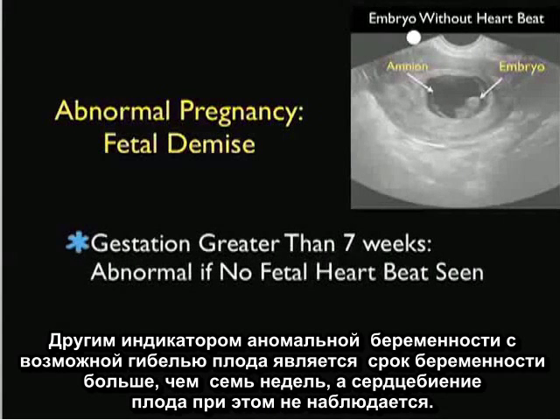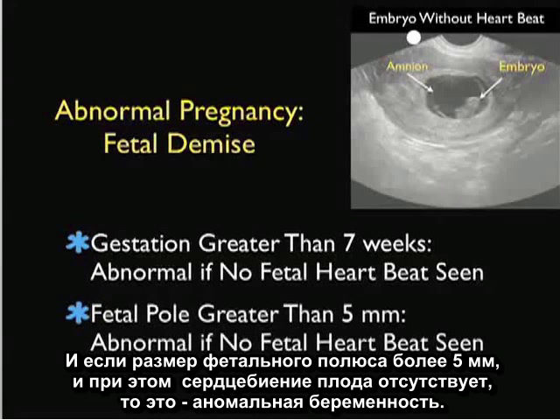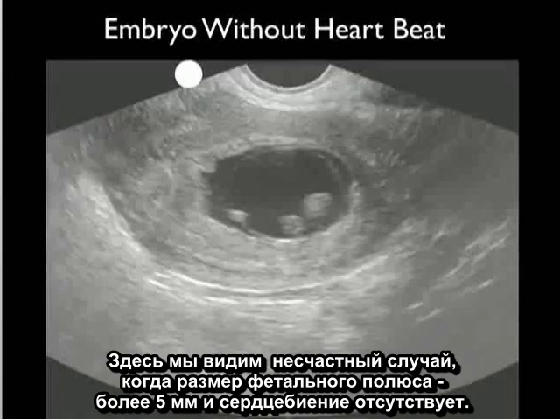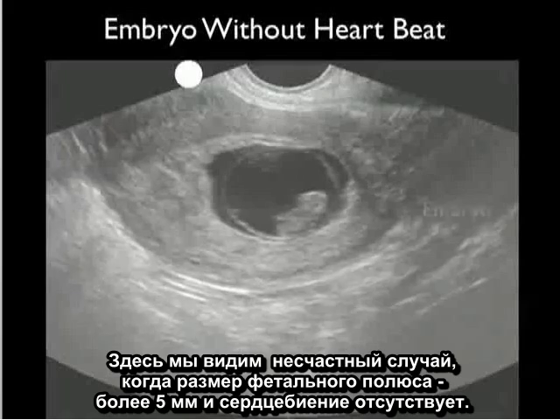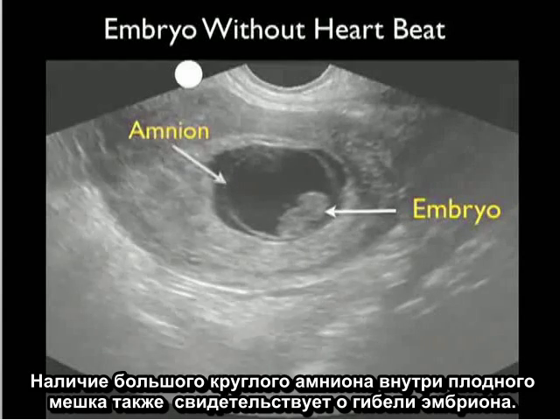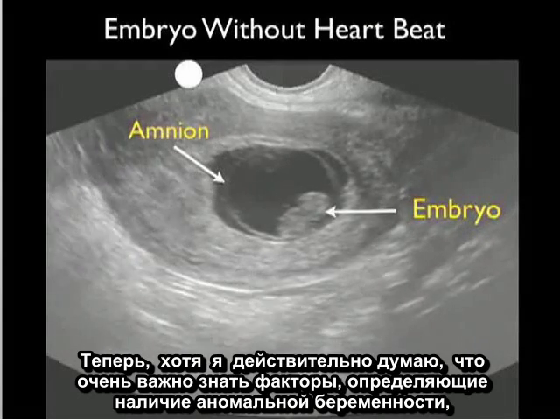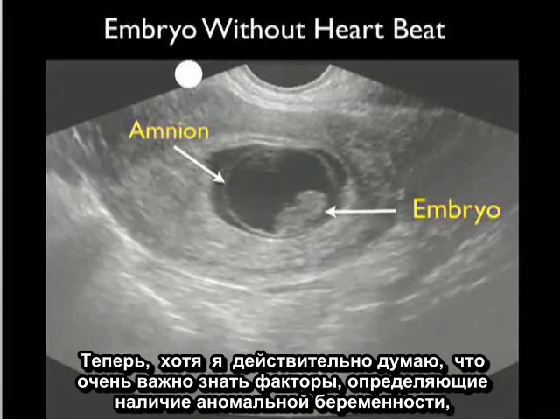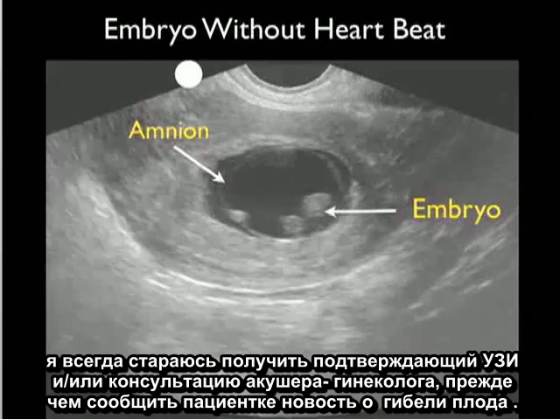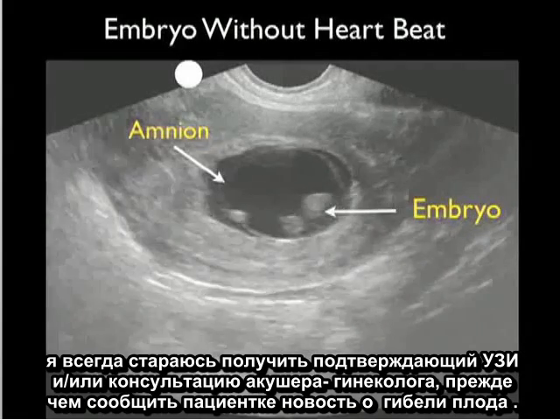Other indicators of an abnormal pregnancy with fetal demise include a gestation greater than 7 weeks with no fetal heartbeat, and a fetal pole greater than 5 millimeters without a heartbeat. This was an unfortunate case showing a large fetal pole greater than 5 millimeters without a heartbeat, indicative of embryonic demise, with a large circular amnion within the gestational sac. I always get a confirmatory ultrasound and/or OB-GYN consultation before giving the patient the news of fetal demise.